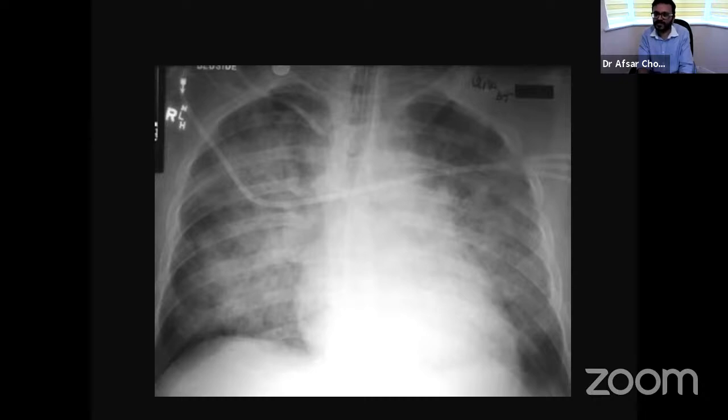But if everything is pneumonia and everything goes well, then in those cases only. And in our practice, we rarely refuse such cases for a CT. Suppose sometimes in a very young patient, 25-year-old, and suddenly you want to know if there is any chance it can be a mass? Definitely, yeah. In those cases, sometimes if it's classically looking like a pneumonia, we can wait and see. But otherwise, because I've seen even very senior radiologists getting it completely wrong on X-rays.